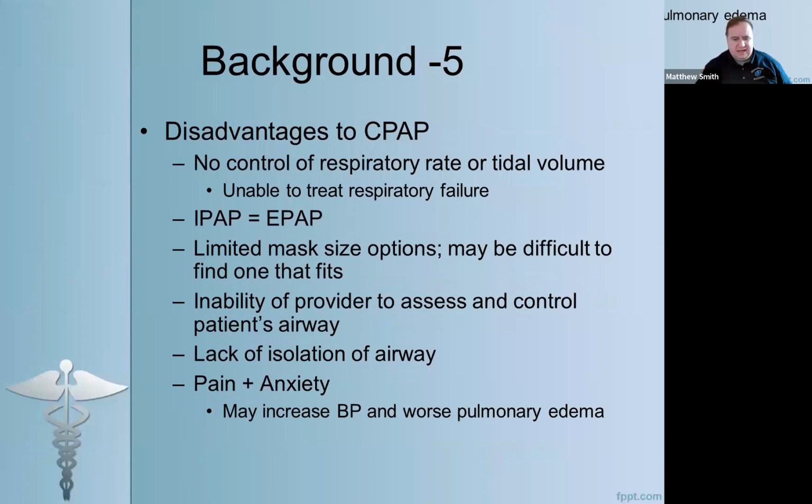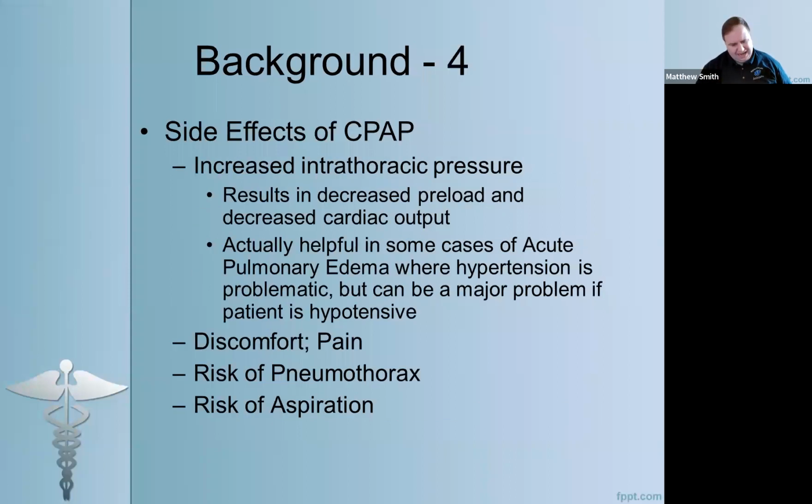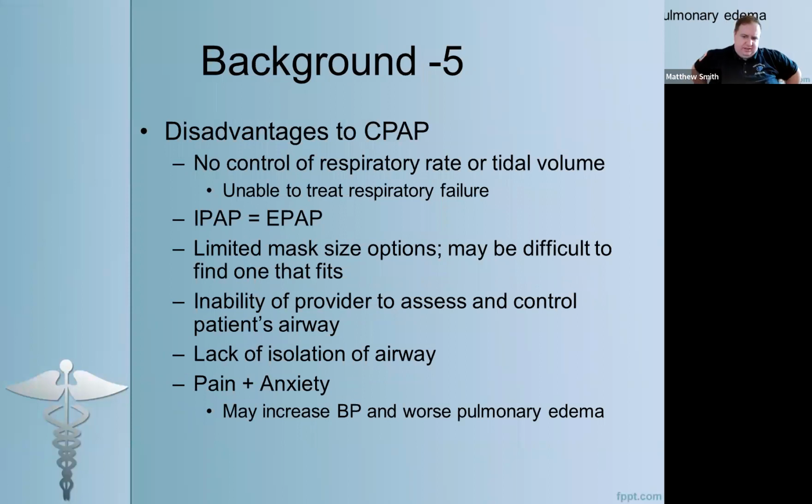All right, so those were our side effects. In terms of some disadvantages to this therapy. So one, I think the first and most important one to be cognizant of is that we are not able to control our patient's respiratory rate nor their tidal volume when we put them on CPAP, which means as a result, we are not able to treat respiratory failure with CPAP. I'm going to say that again. You cannot treat respiratory failure with CPAP.